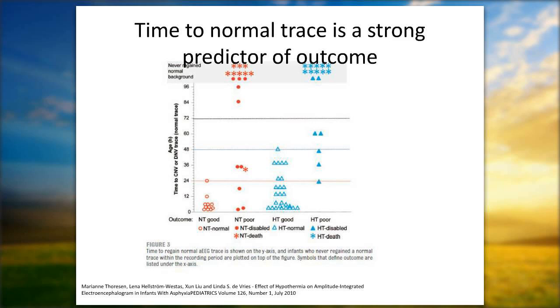The trend is so powerful and so easy to use. I think our neurology colleagues, as they begin to see that value, will really enjoy using the trend, and then have the benefit of also being able to look at the details of the EEG for other subtle findings for prognosis. But for trend and prediction of normality, having the trend at the bedside is so important.